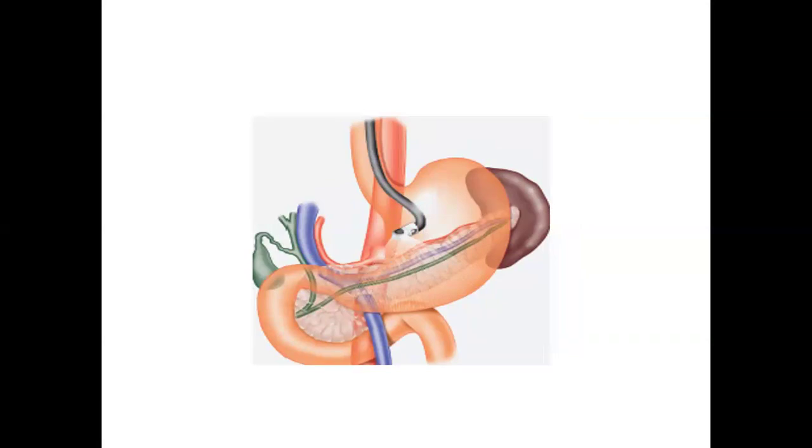So as you can see, there are some lights there. It gives us an angle of the images that we are going to pick on our screen. So we can move this instrument forward, we can move backwards, clockwise, counterclockwise, and study the structures that we want.